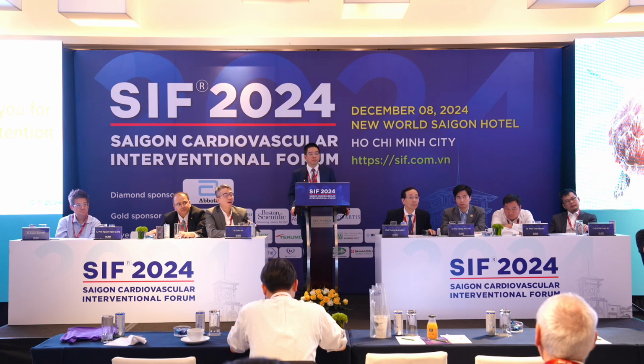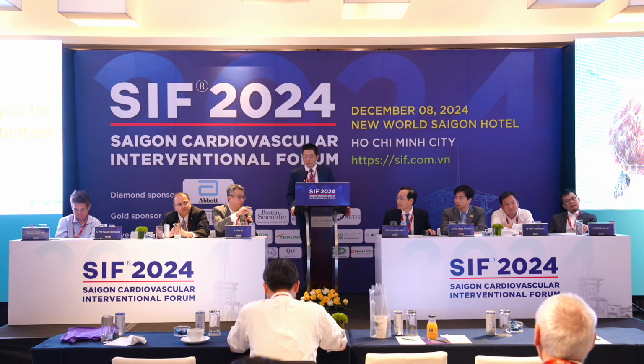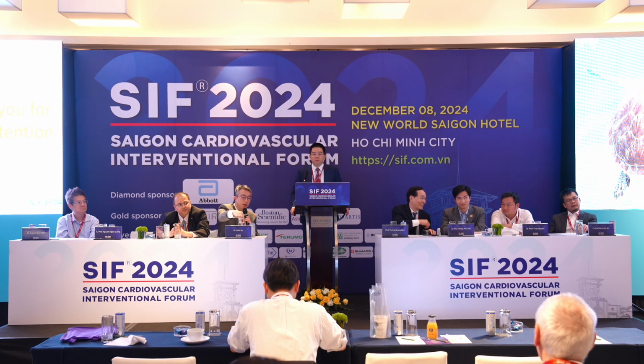It's much better than the retrieval device that comes with the spider filter. Much better. Very, very important. Because of time, I did not explain that the filter wire actually will make your wire bias to the wall of the vessel. So you put one balloon or inflate one balloon to centralize the wire, then it will be easier for you to pull it out.